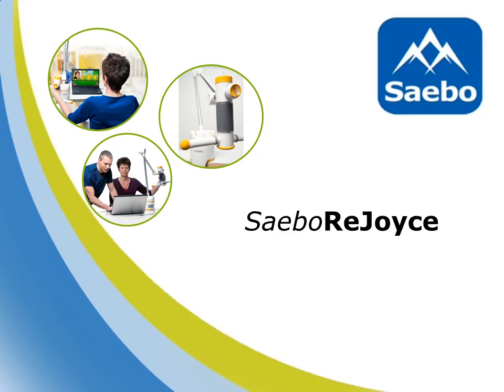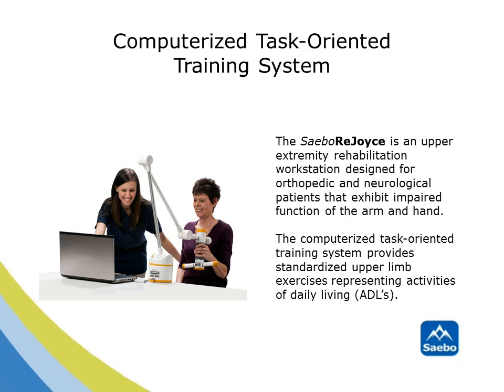Welcome to the SABO Rejoice, a novel and revolutionary computerized task-oriented training system. This one-of-a-kind upper extremity workstation was designed specifically for patients who have limited arm and hand function, such as neurological and orthopedic patients. The computerized task-oriented training system provides standardized upper limb activities similar to everyday common tasks and ADLs.